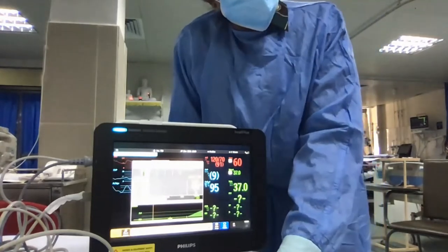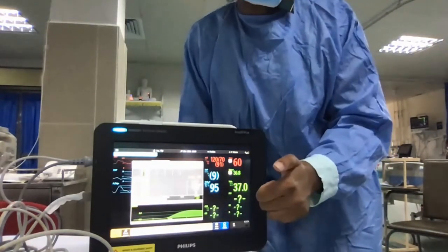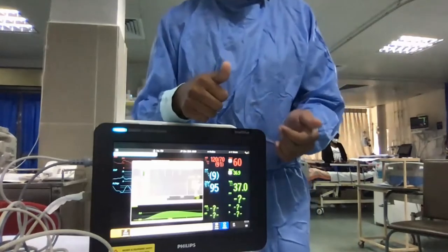Sometimes you will get a signal saying unstable baseline, injection not recommended. So don't inject during that time. There can be temperature drifts and all, madam. So wait for the monitor to stabilize the baseline, and then only you can inject.